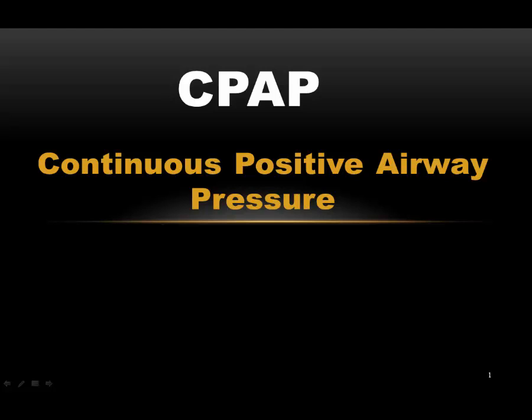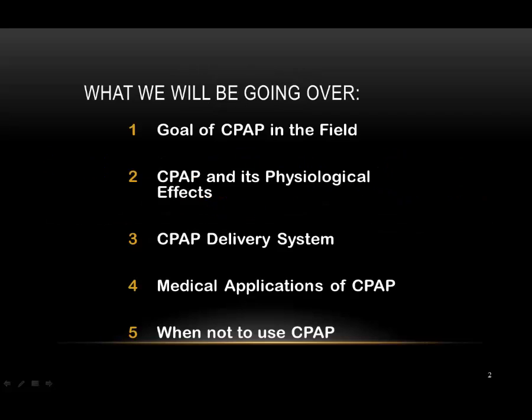CPAP is the application of positive airway pressure throughout the whole respiratory cycle to spontaneously breathing patients. We will be going over the goal of CPAP in the field, the physiological effects, how it's delivered, the medical applications, and when not to use CPAP.